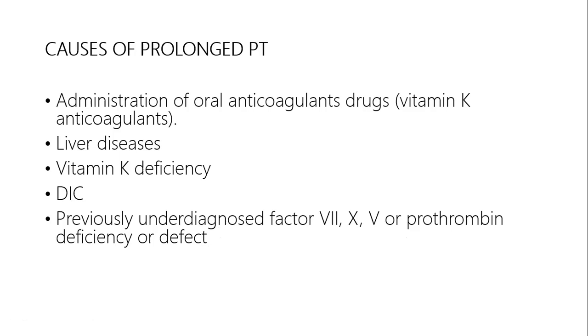Probably the patient has a deficiency in any of the vitamin K dependent clotting factors, and that's why the PT of the patient is prolonged. Right?